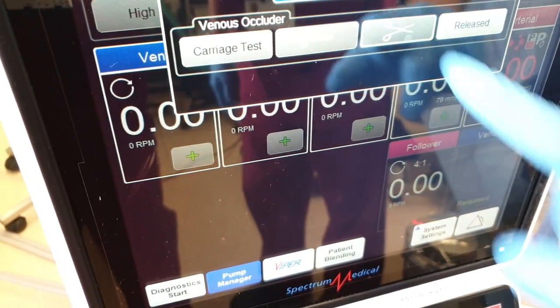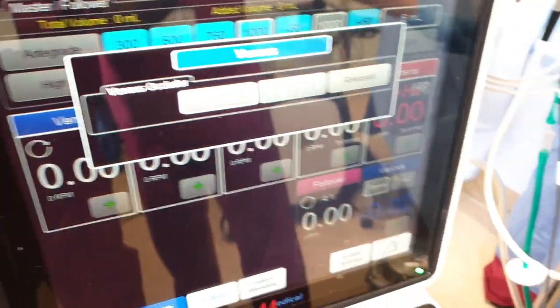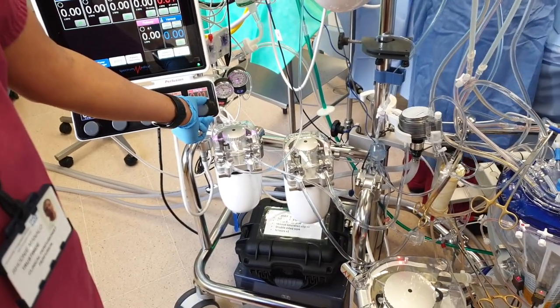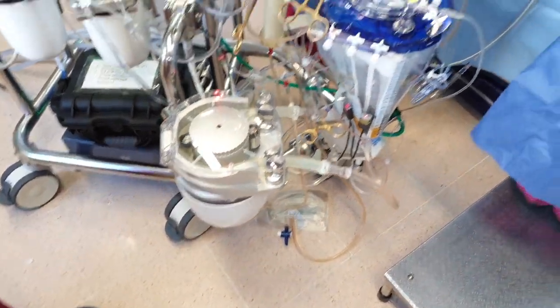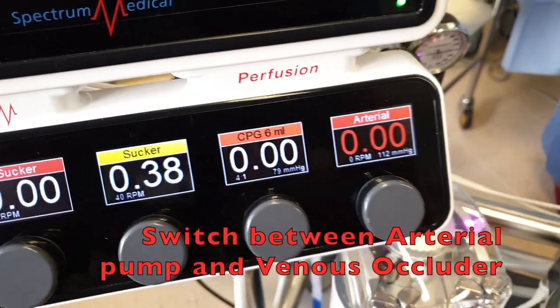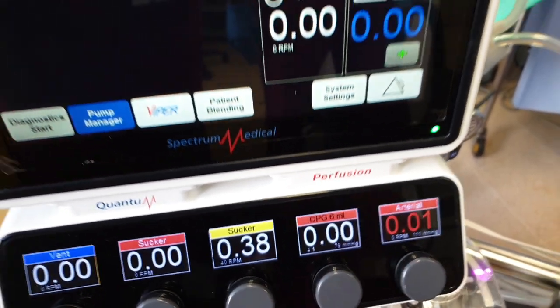After putting that in, you can do this. So it's open. It's ready. It's still open. Yeah, and then you buy the line. Okay, coming up. Okay, 2 feet. Same. Check and clear, thank you. Up on the yellow, please. Yellow up. If you push it in, then it goes down to venous. That's a venous occluder. Push it back home. Oh, great. Okay.